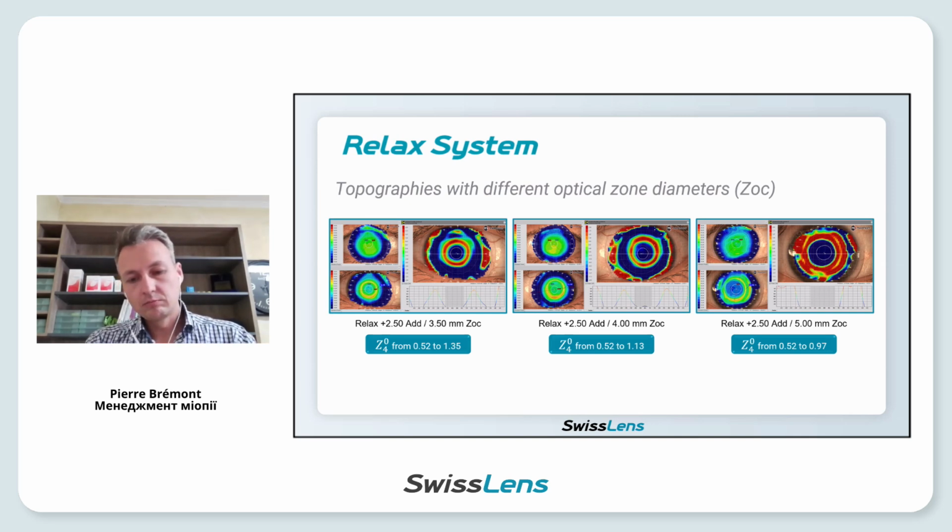The goal in spherical aberration is to increase by 0.5 minimum. So if we look at the result, even the 4 millimeter is okay. The 5 millimeter is a bit too low.